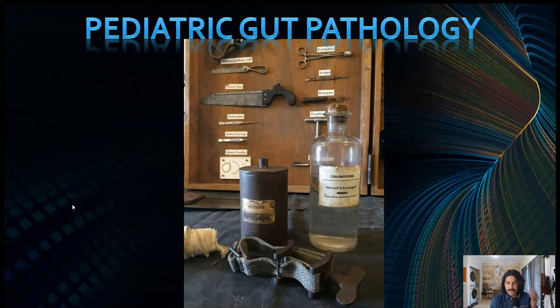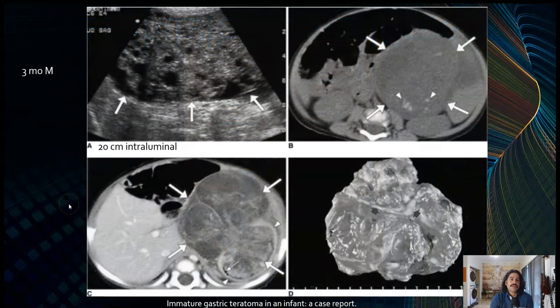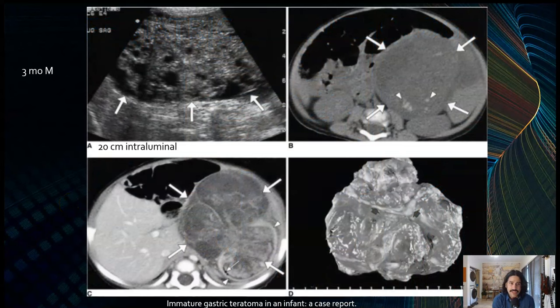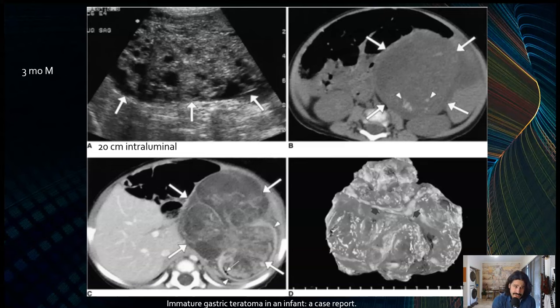Now let's go over some pathology, beginning in the stomach. Quite frankly, you're not going to see a lot of gastric pathology — that's going to be more an endoscopic diagnosis or CT/MRI. But here is a three-month-old with a 20-centimeter intraluminal lesion of the stomach.